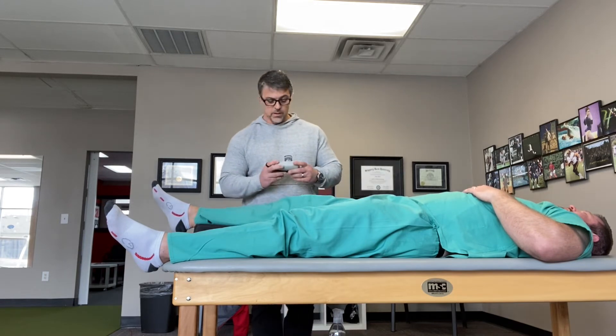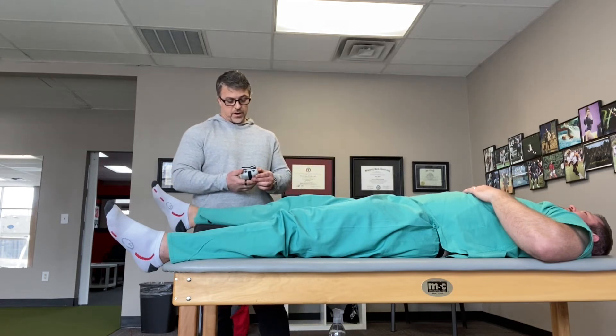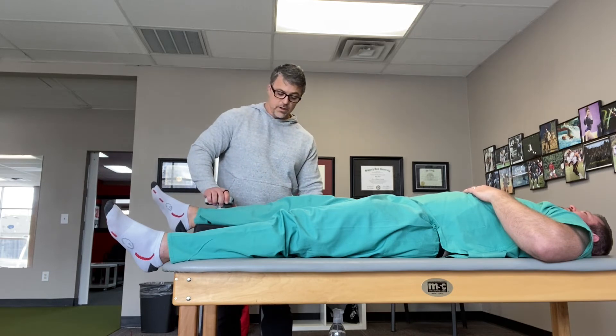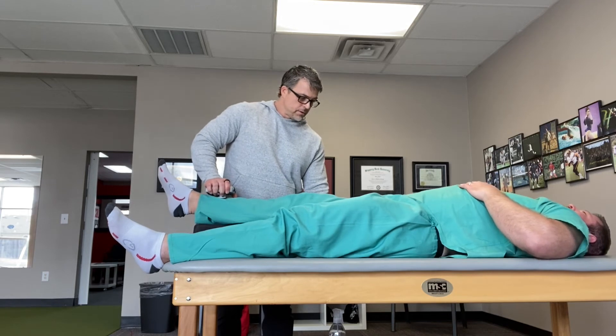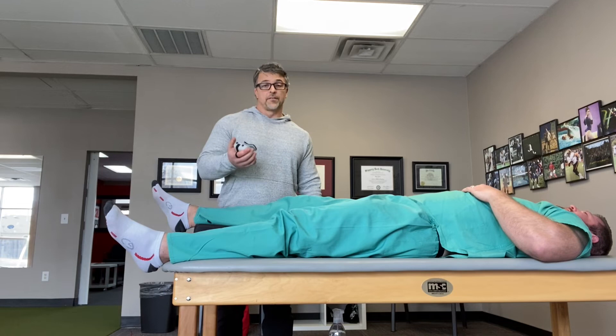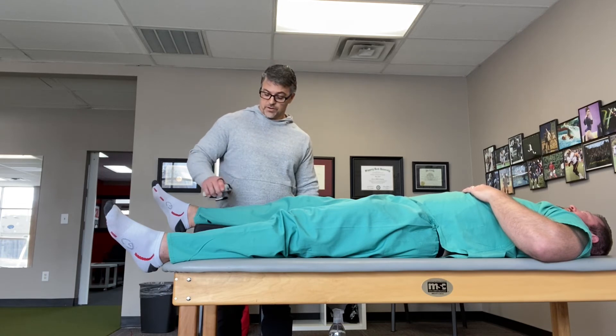So now, same thing — you're going to push as hard as you can until you hear the second beep. Ready, go. Go, go, go. Good. Okay — 35 foot-pounds. So we've just lost strength.